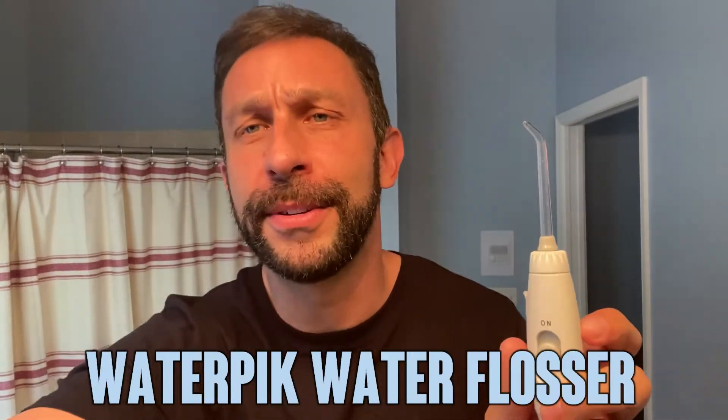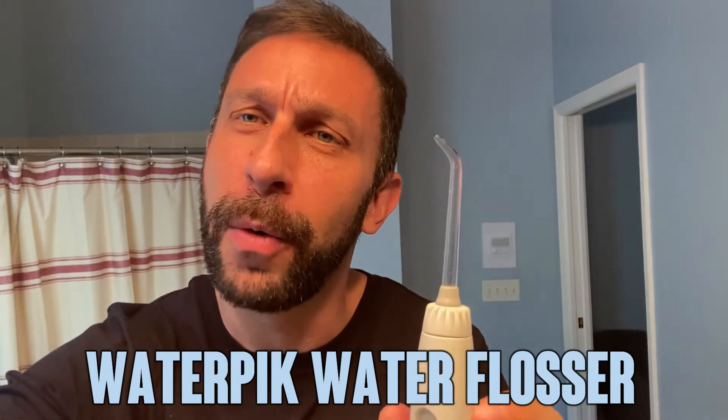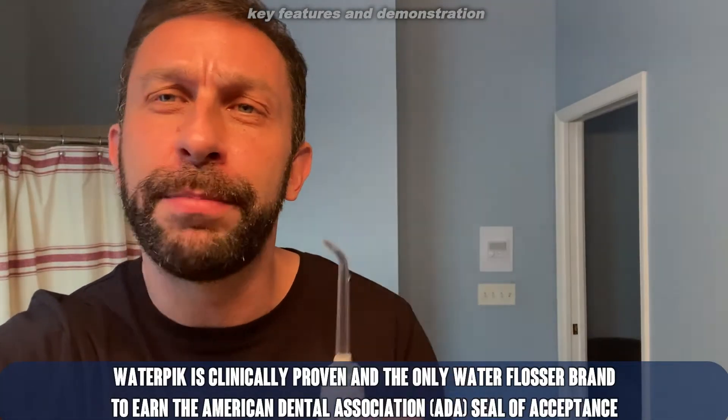Hey folks, Adam here from 911 Studios and today we're looking at this fantastic water flosser by Waterpik. First I'm going to go ahead and turn it on — right now it is in floss mode and you can just run it across your teeth. I spit out the excess water and I'm really getting in between my teeth in a healthy manner. You see the easy on and off, and it comes with a variety of picks.